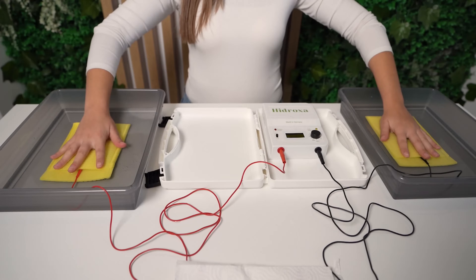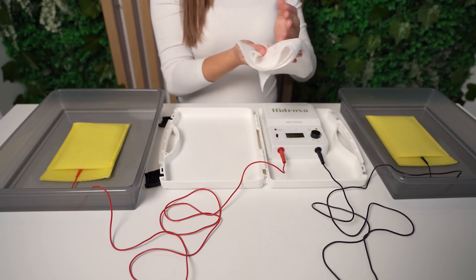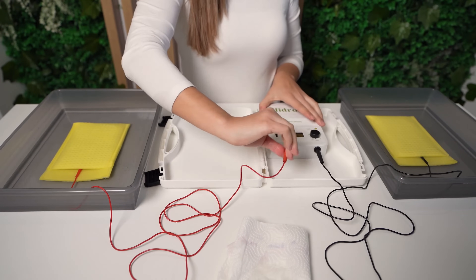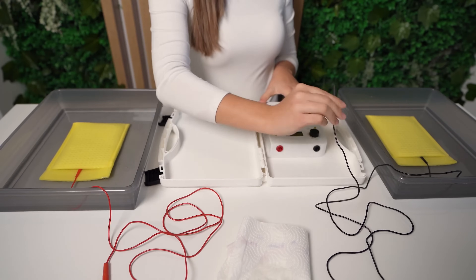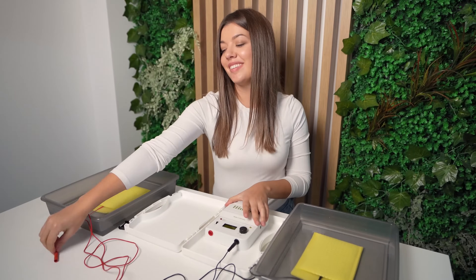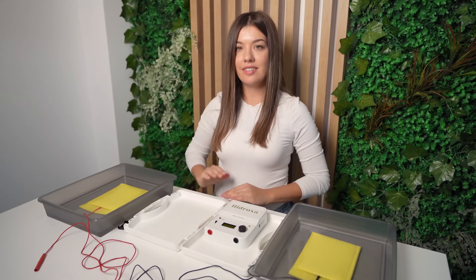After finishing the treatment, switch the device off, remove the electrodes from the water, and remove the red and black cable from the electrodes. Empty the plastic containers and wash the electrode pockets in lukewarm water. Leave the electrodes in the pockets while washing them, because they can sometimes be a little tricky to put back in place again. Then, put them aside to dry. You can leave the cables in the electrodes to avoid electrodes being worn out.